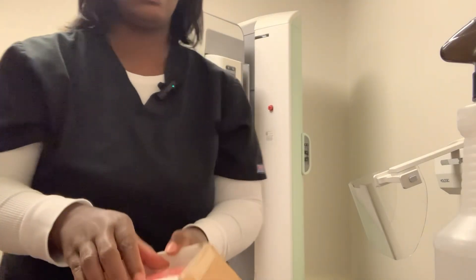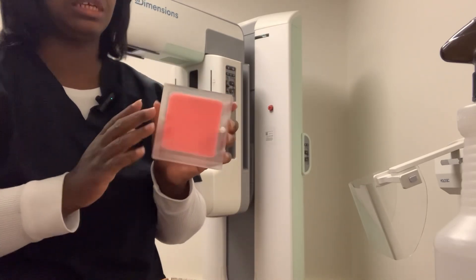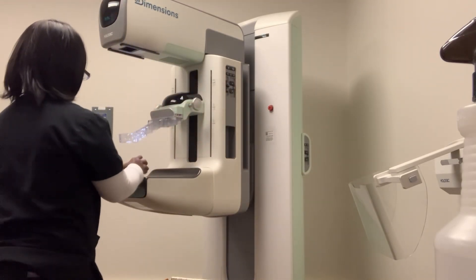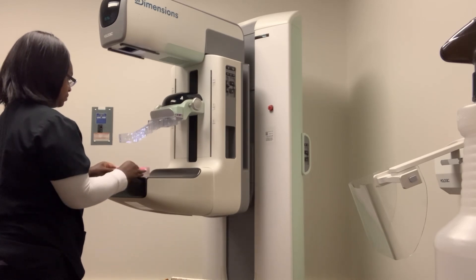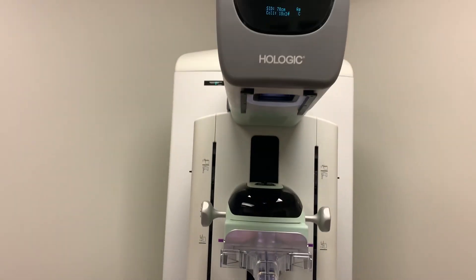Now I'm going to grab my Phantom and put it on the Mammography Machine. Okay, this is how everything is looking.